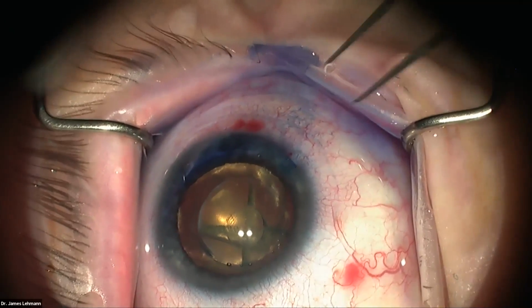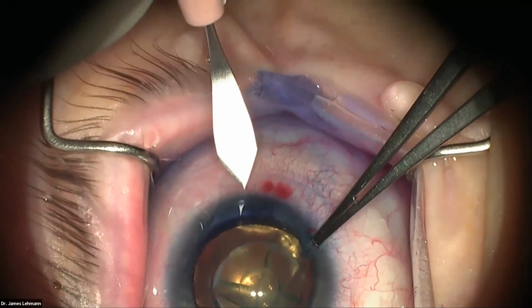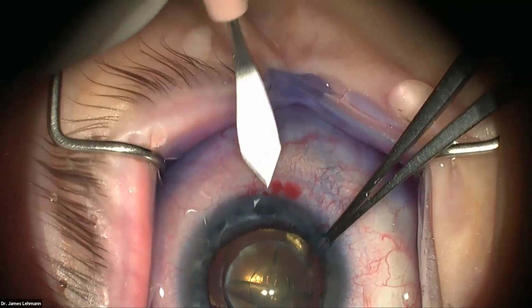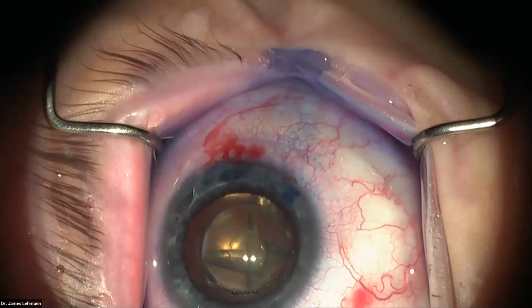We're going to go over wound construction during the lecture part, but basically I like to do it at the limbus, and you want to get some of the vessels there so that you have a little bit of bleeding, and you want to try to make it as square as possible. See some bleeding from the vessels there? That tells you you have a good incision that will heal well.